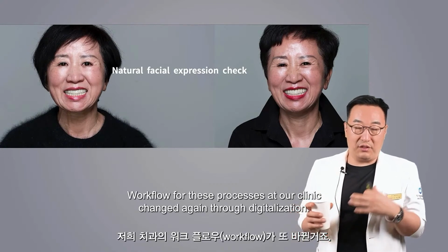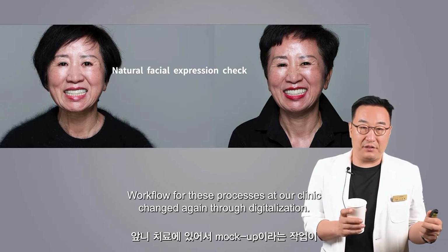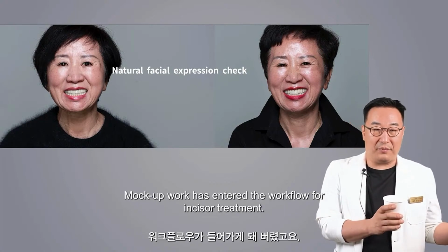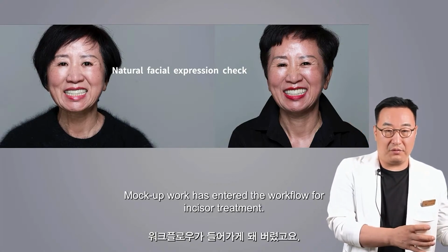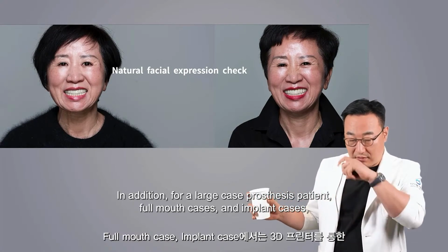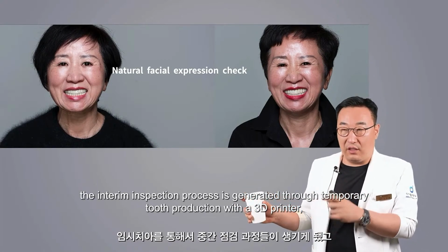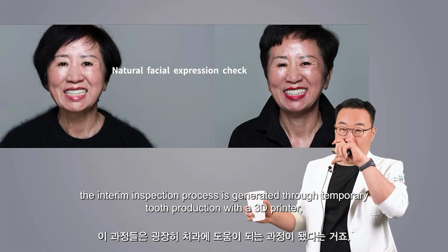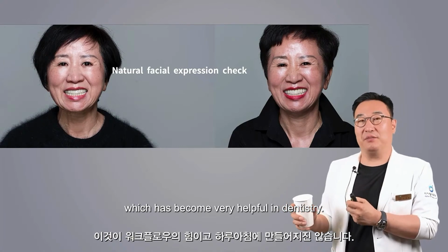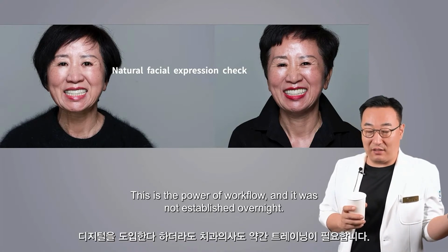Workflow for these processes at our clinic changed again through digitalization. Mock-up work has entered the workflow for incisor treatment. In addition, for a large case prosthesis patient, full mouth cases, and implant cases, the interim inspection process is generated through temporary tooth production with a 3D printer, which has become very helpful in dentistry. This is the power of workflow, and it was not established overnight.